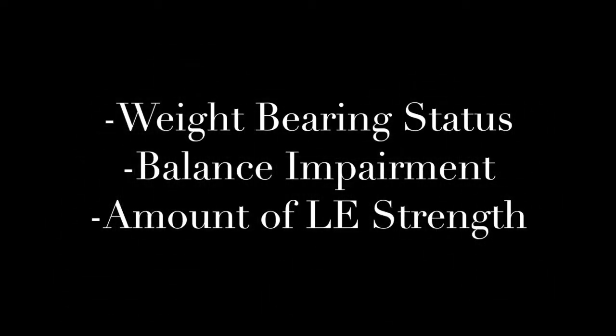When choosing an assistive device, you should look at the amount of weight bearing, balance impairment, or amount of strength they have in their lower extremity. There are charts in your handout that should help with decision making based on these three characteristics.